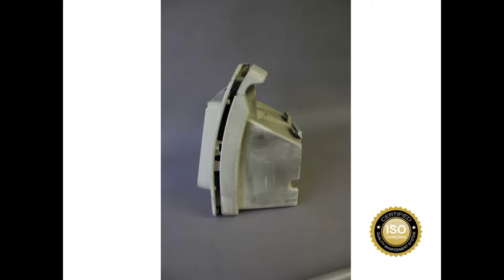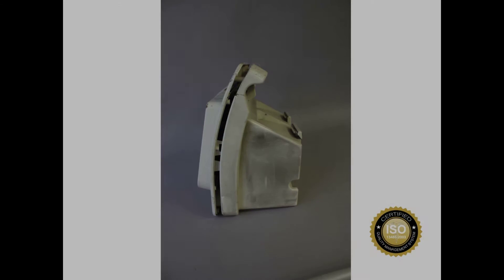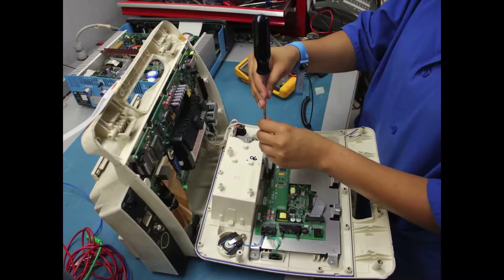Items are now brought back to their original manufacturing specifications. Batteries are replaced, electronics checked, full diagnostics performed, and all connections are confirmed. The unit is then calibrated and a report specific to each serial number is documented.